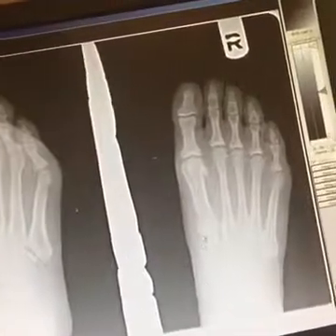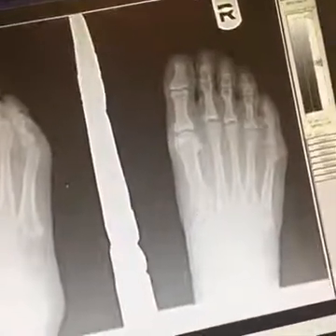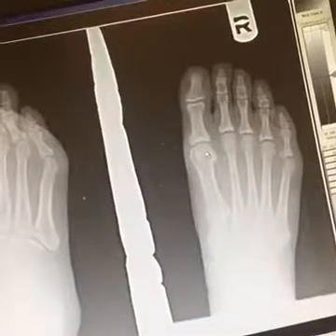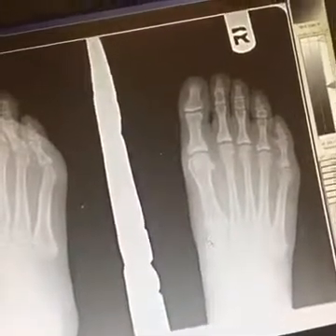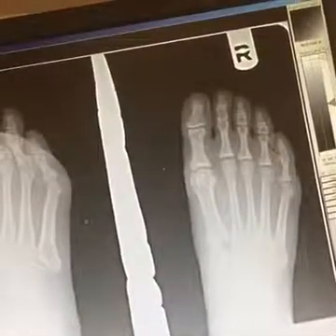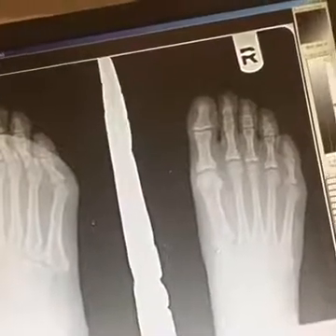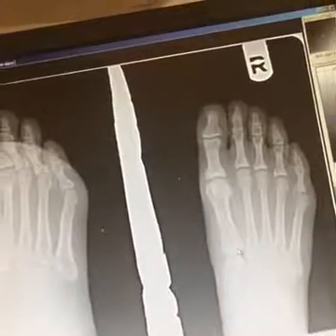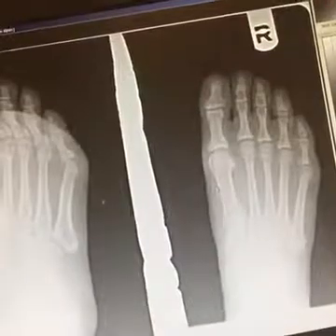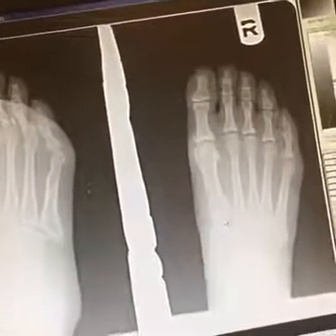The last thing I want to point out is the first ray — the met cuneiform joint — which is the epicenter of a bunion. Bunions are not a first MPJ issue; they are actually a first ray issue. What often happens is there is an instability at the met cuneiform joint. You can see how it is angled — when you lose stability of this joint, that allows the first metatarsal to swing out to the side and the toe comes in, and that's what creates the classic bunion.